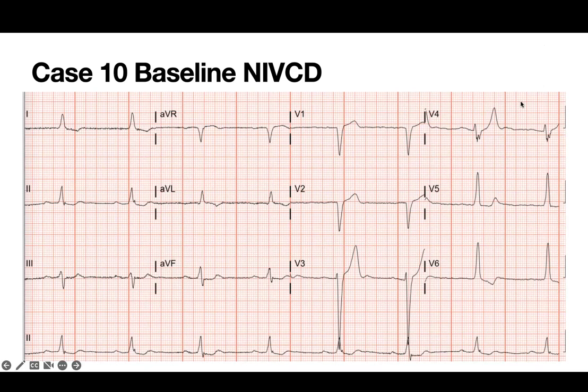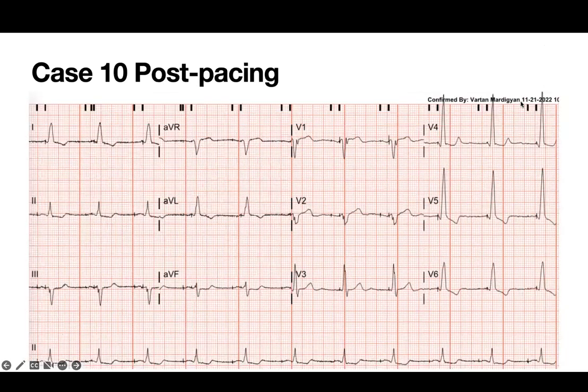That would be nice to see. Yeah. We have the same problem when we do cases in the hybrid suite for extraction. You're all scrubbed, the chest is scrubbed, so your V1 is a little far from the sternum, and you don't have all your leads. We tweak the anesthesiology monitor and measure from there. It's not as easy as in the EP lab, but it's manageable. But you don't want to do your first cases with that type of setup.